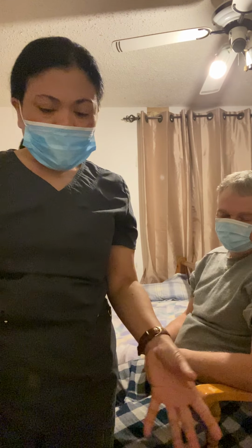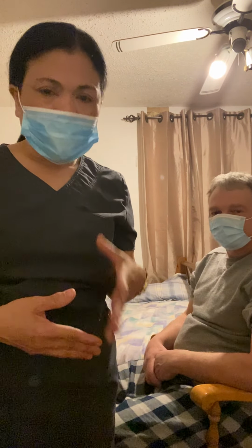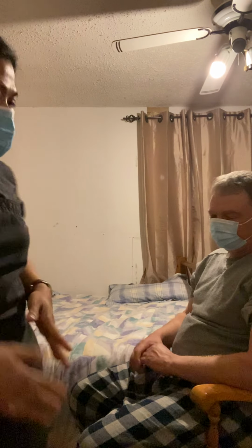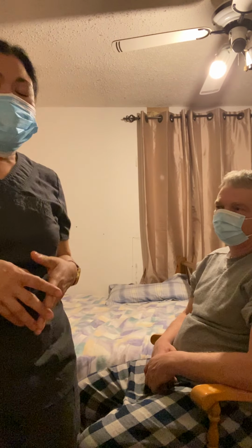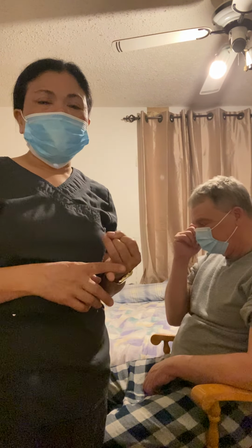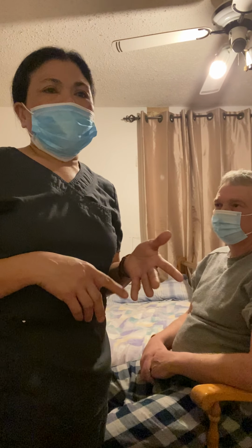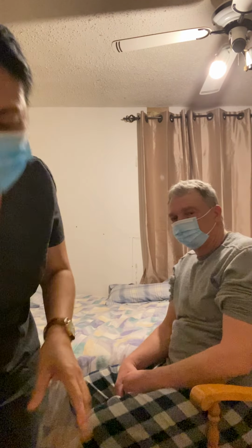So we will clean all the items that are not disposable, and then we perform hand hygiene, and then we will wear the appropriate PPE if necessary. Now, what is being collected during the vital sign measurement? Well, we will take the patient's blood pressure, the heart rate, the respiration, and the oxygen saturation, along with the pain rating.